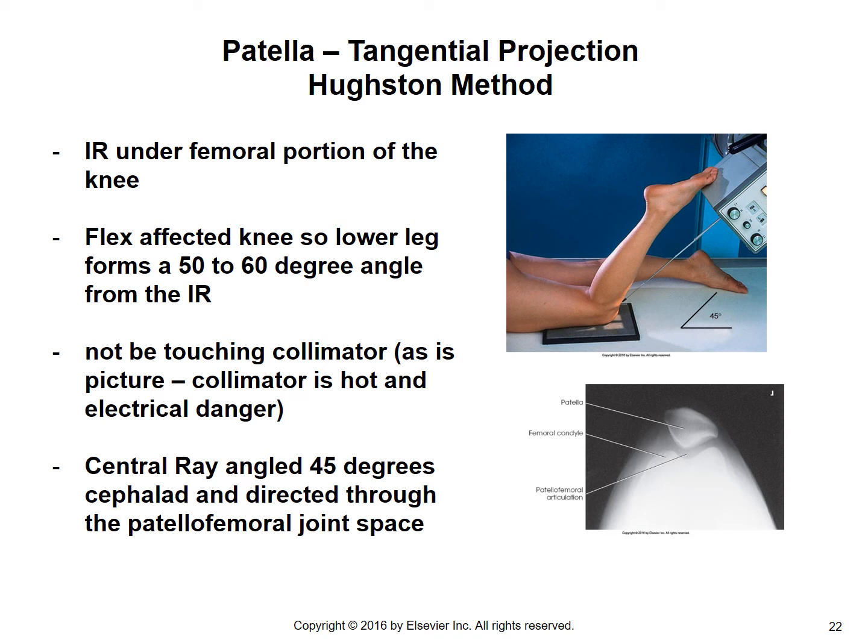Interesting, I want you to look at this. The foot is resting on the collimator. It's not something I would suggest, from being in clinical. The collimator gets hot, and also anytime you're going to take an x-ray, you don't want to have the patient in contact with the x-ray tube or the collimator. In the unlikely event that there would be a short, the patient could be shocked. So probably not a good idea to rest it on the collimator.